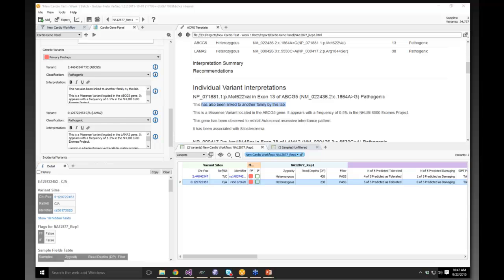How frequently are those annotation sources updated? Is it automatic? It is by our curation team. Things change, so we can't just put everything on an auto script.